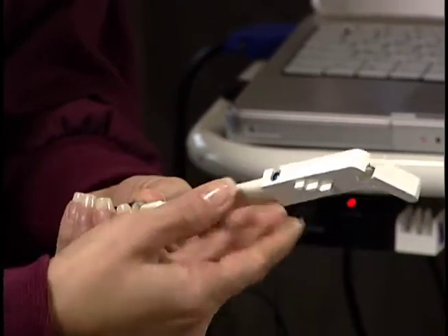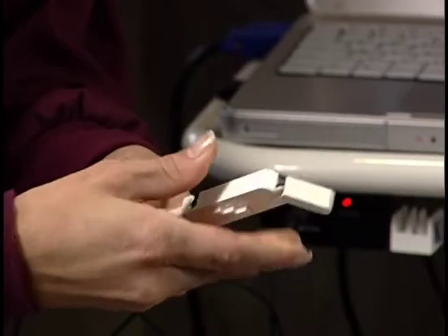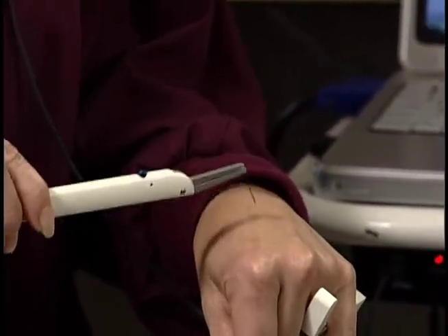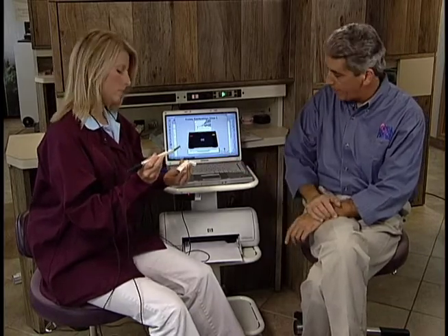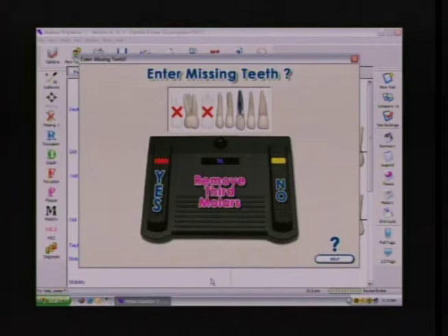Hold the silver, turn the handpiece to snug. Take off the protective cover. Push it against your gloved hand to make sure it's free-floating, not bent or kinked. Is it okay? Perfect. All right, let's calibrate. Depress it fully, hold it, step quickly. Nice pause, then release, and step again. Okay. Do you want to record the dentition? Yes. Let's say yes with the foot pedal.